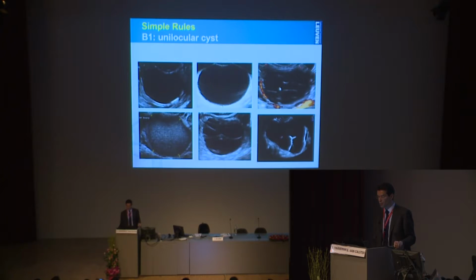But this case is hemorrhagic. So these are fibrin threads. And for this, again, it's useful to switch on your color Doppler to make sure that there's no blood vessels inside, because then you have to change your mind. You can gently touch upon the tumor with your probe to see whether you see this jelly-like movement. And in that case, you are absolutely certain that it's hemorrhagic content. Blood clots, fibrin threads, you see them moving if you touch upon the cyst. If it's a multilocular tumor, the septa go along with the cyst, but there's not this jelly-like movement. So this is helpful as well.